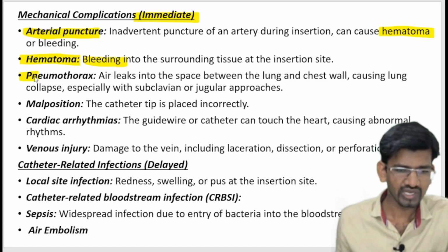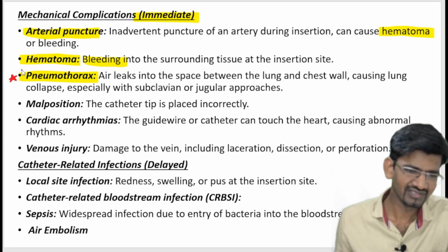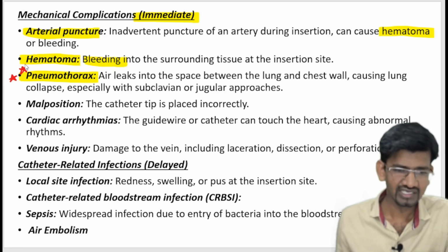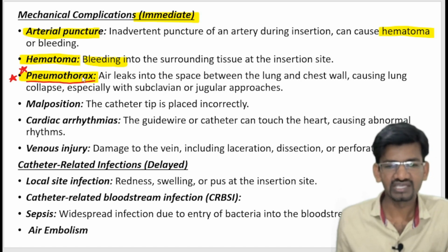Then pneumothorax, very important. Recently, I think even in NORCET 9 this question has been asked. Pneumothorax is the most common complication of central venous catheterization.